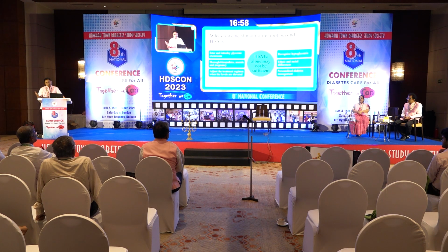Again, there are differences with the ethnic and racial differences in the A1C level, and definitely personalized diabetes management, that is the crux of diabetes treatment in recent days, different guidelines, that the individual patient who is sitting in front of you, you have to personalize treatment, so that we can't differentiate from this A1C. So this is a game changer, definitely, and this is the AGP report that we get from any of the patient, and we can see this is the ambulatory glucose profile.